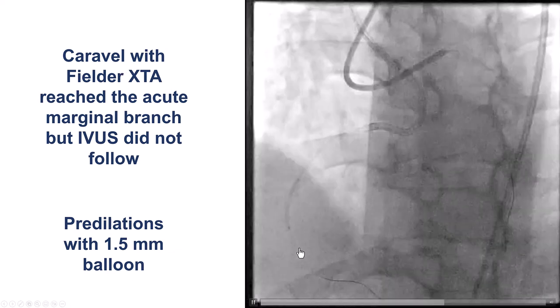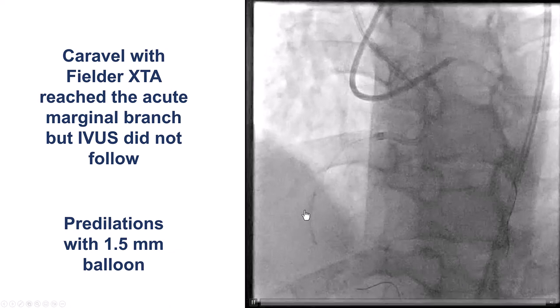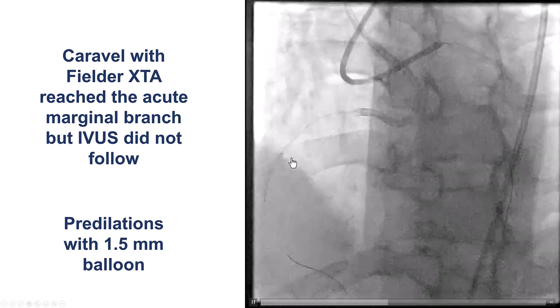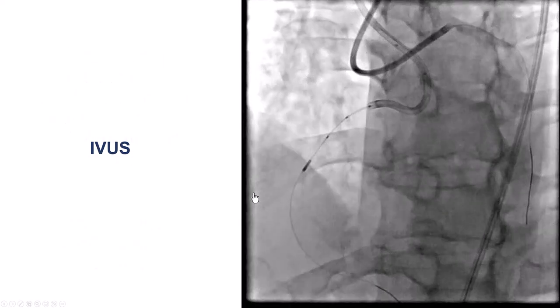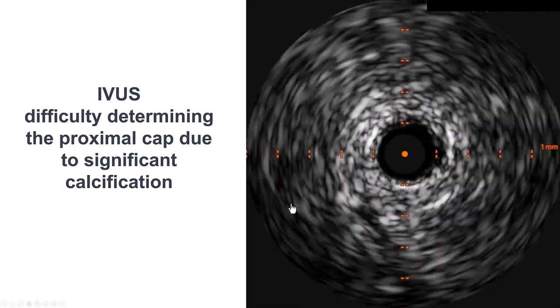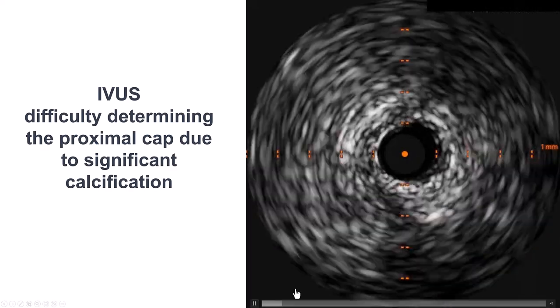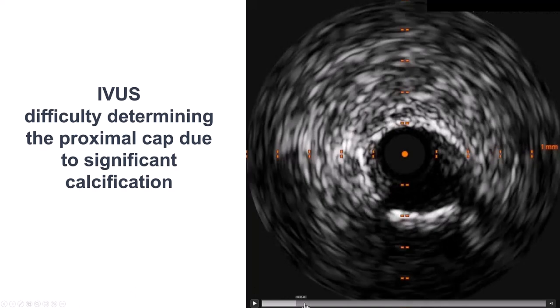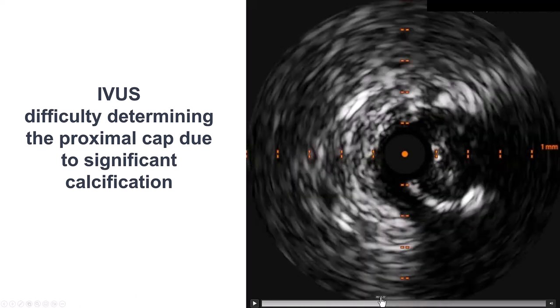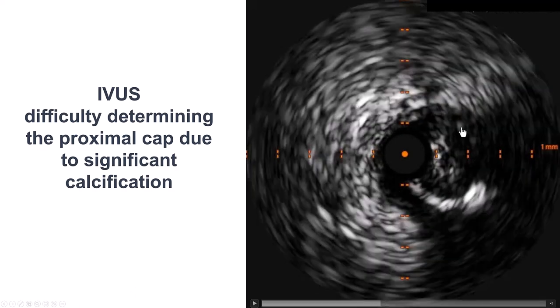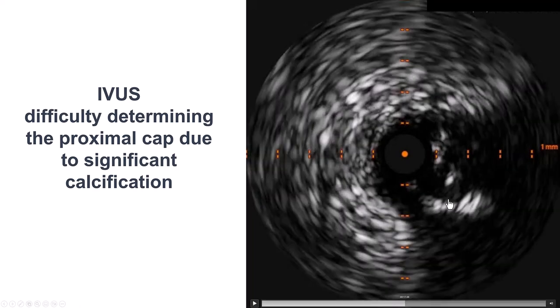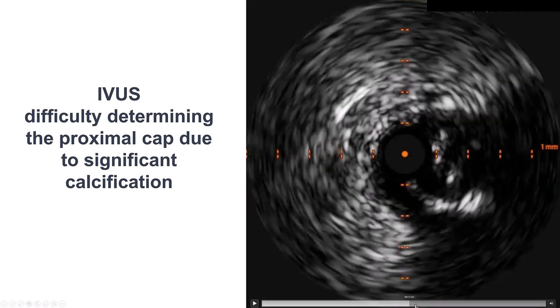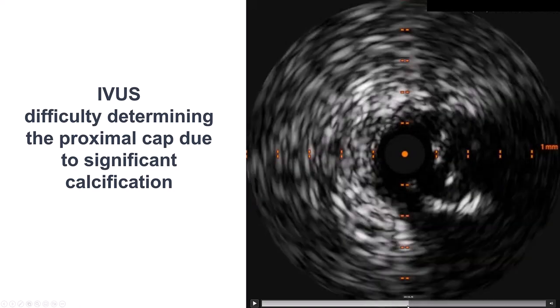We advanced a guide wire easily into the acute marginal branch, but could not deliver the IVUS because of disease and calcification. We did a predilatation with a 1.5 millimeter balloon, and then were able to deliver the IVUS and try to determine the proximal cap. Unfortunately, one of the limitations of using IVUS is that it does not work well when there is much calcification. Here, it was really hard to tell exactly where the proximal cap is, and we cannot see behind the calcium.